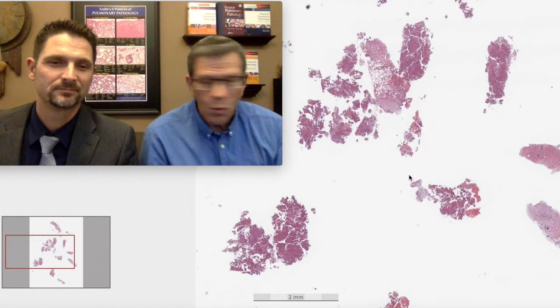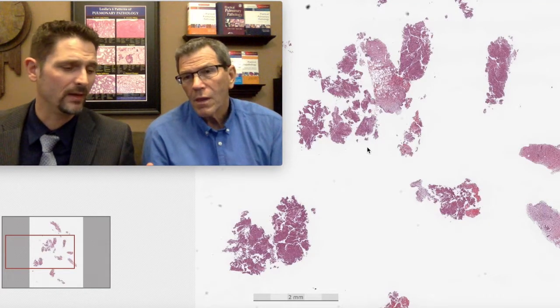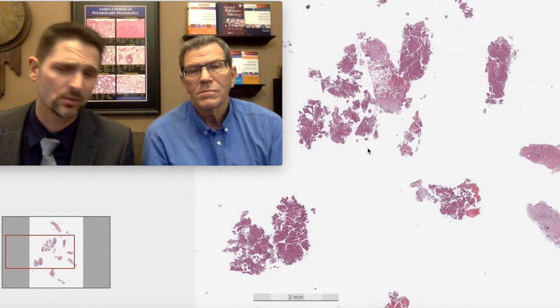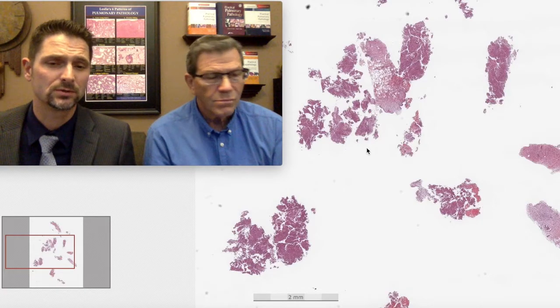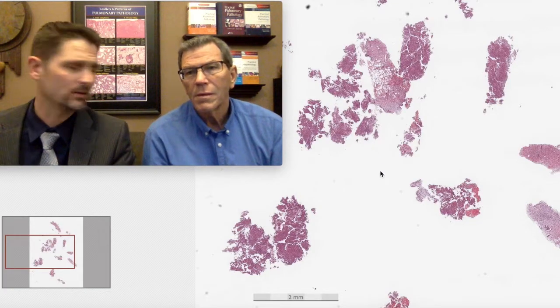Okay, so a needle core biopsy was done. Transthoracic. Pleural-based mass lesions. And we've talked about this, I think, but needle core is a great specimen to get in pulmonary pathology because we're always complaining you need radiologic and pathologic and clinical correlation. But with a needle core biopsy, you have most of the information you need, because they only put needles in the chest for nodular disease. So we have to make sure they biopsied something that would look like a nodule radiographically, and then we can make our diagnosis. And certainly they've biopsied something that would look like a nodule. This is not normal lung. This is not normal chest wall soft tissue, although there's a little bit of adipose tissue here.